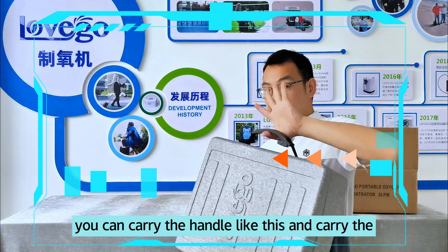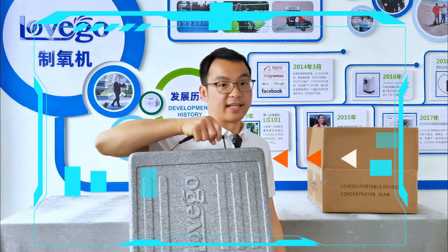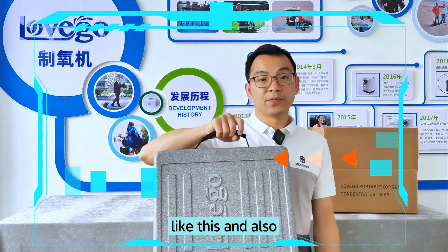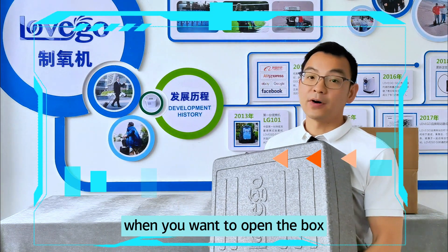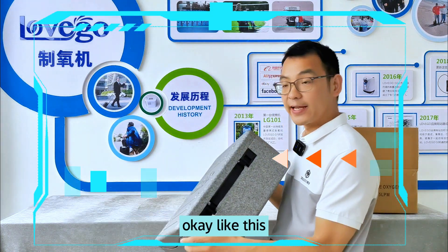The handle that you can carry like this and carry it anywhere when you go outside. And also, when you want to open the box, let's just open the two box buckles like this.